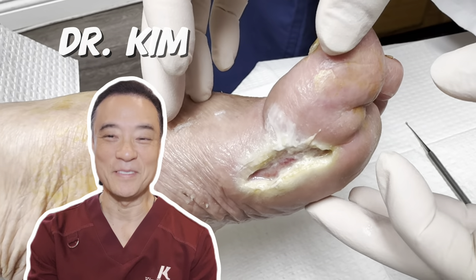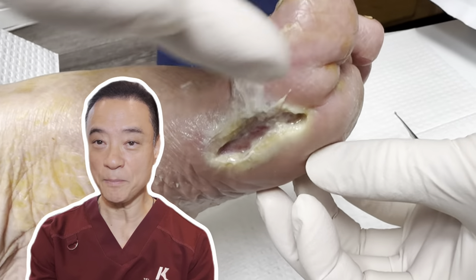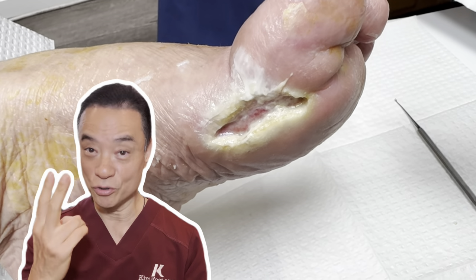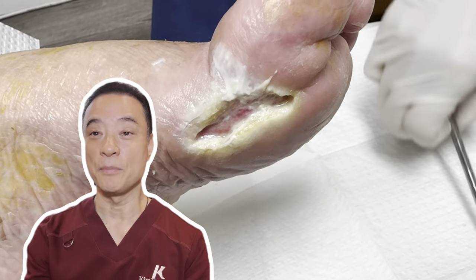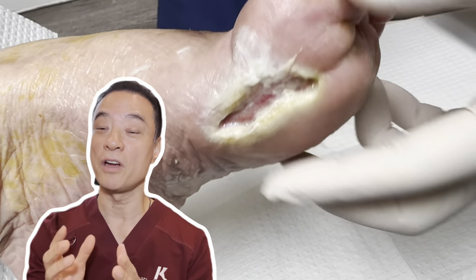Hi, everyone. This is Dr. Kim, America's holistic foot doctor. In this video, you meet my diabetic patient who has a large ulcer on her big toe. She had two surgeries due to an infection. I'll be using a new grafting material to heal the wound very quickly.